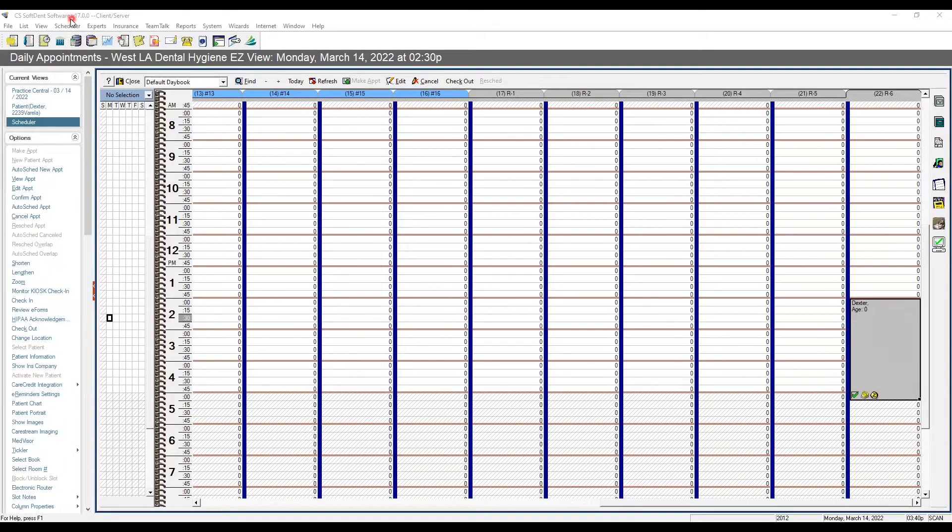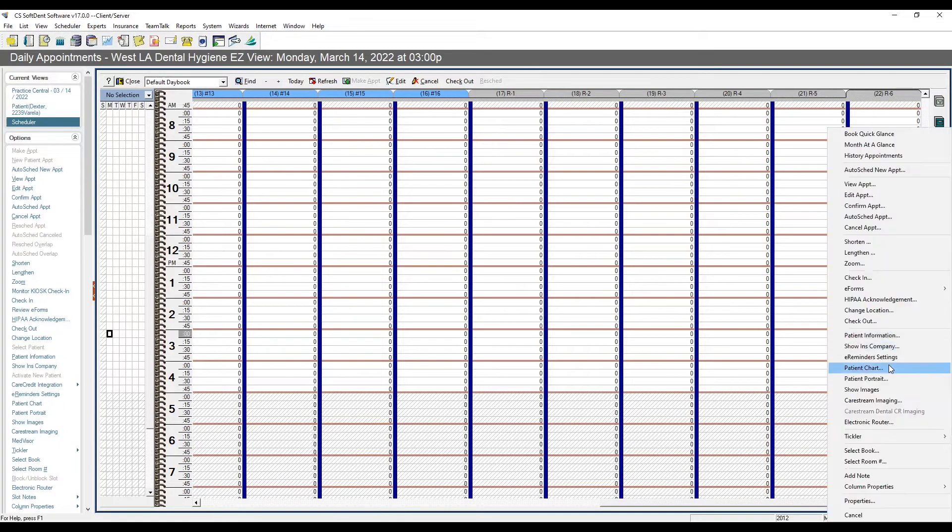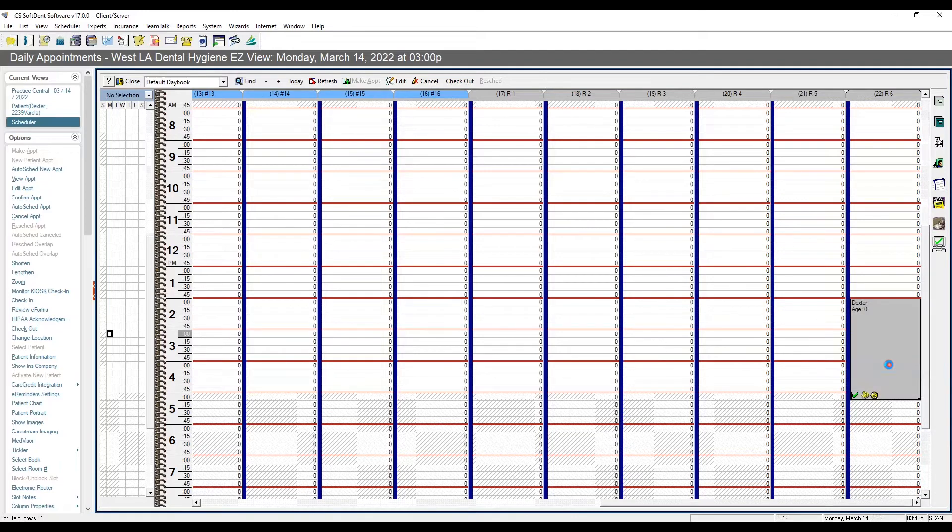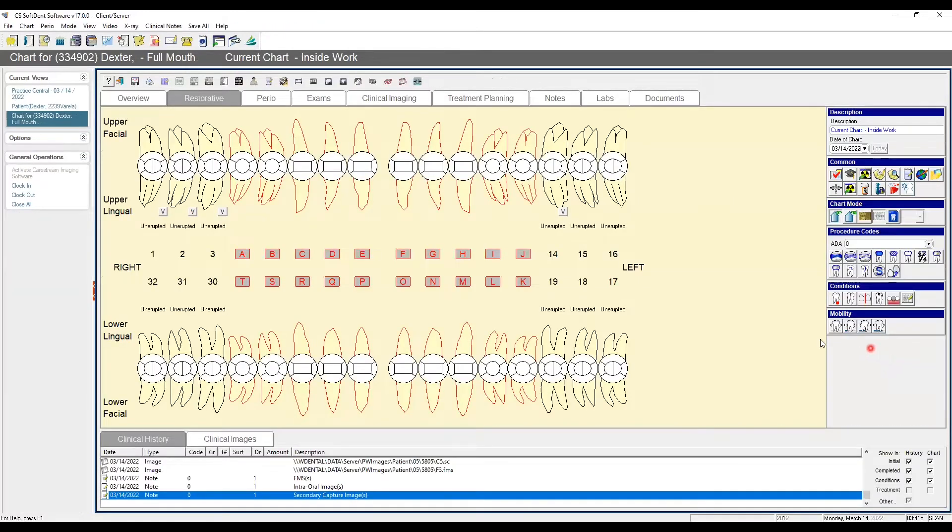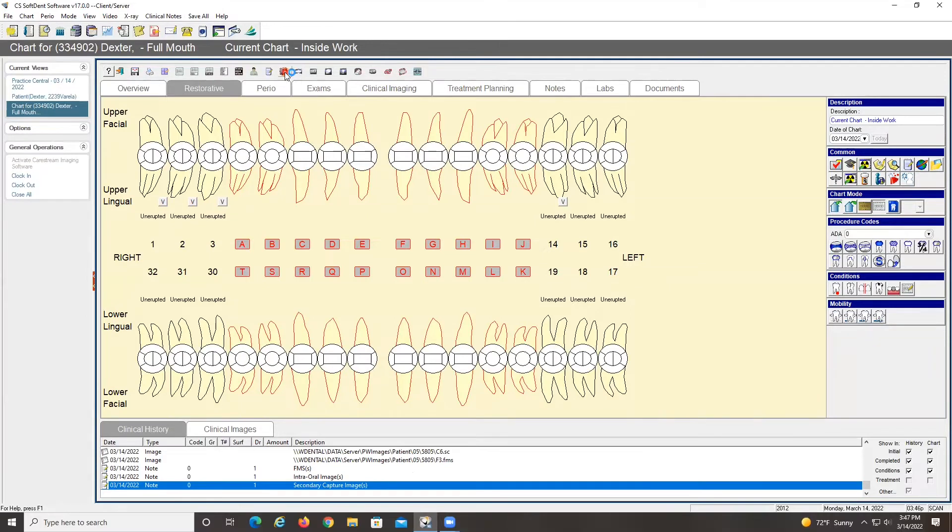So upon turning on the phosphor plates scanner, we're going to go ahead and access scheduler, daily appointments, head to our patient's chart. And from here, we're going to go ahead and head to the x-ray section right here, the little lion.